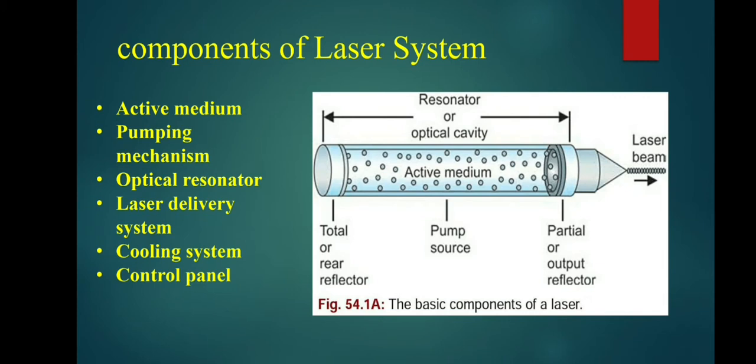Cooling systems. Heat production is a byproduct of laser light propagation. It increases with the power output of the laser, hence with heavy-duty tissue cutting lasers. The cooling system represents the bulkiest component. Coaxial cooling systems may be air or water assisted. Control panel. This allows variation in power output with time, above that defined by the pumping mechanism frequency.